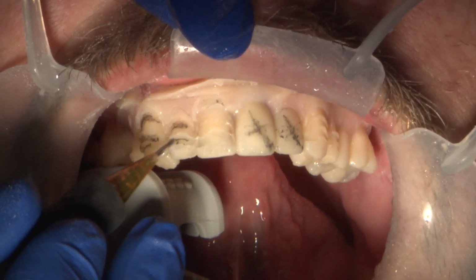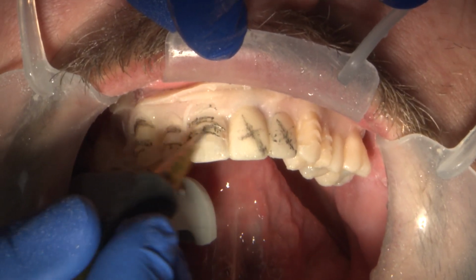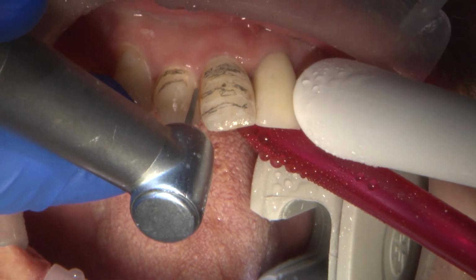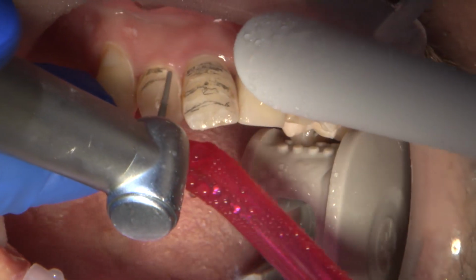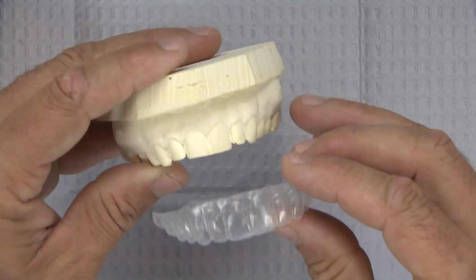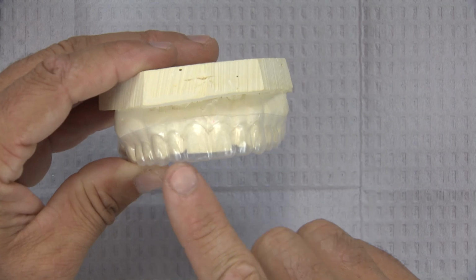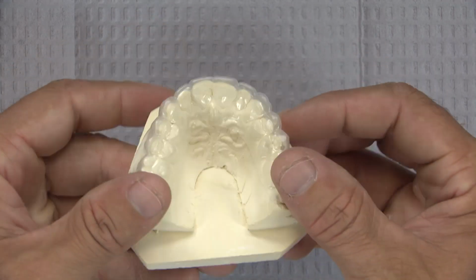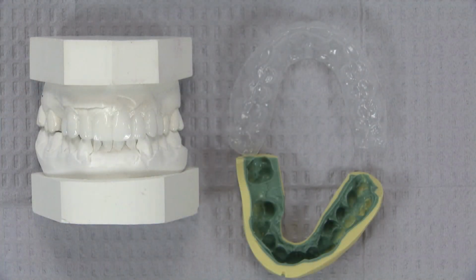Then, on our initial prep date, mocked up once again in acrylic to perform depth cuts for minimal prep veneers. In cases where biotemps are not used for temporaries, this putty stent can also be utilized as a chairside temporary matrix. Additionally, a plastic preparation guide based upon the diagnostic wax-up is requested to show my doctor if she's made the proper reductions to allow the final restorations to be fabricated with at least minimal thickness parameters in place. I always double check to make sure that all items are received by the time our patient returns for the next visit.